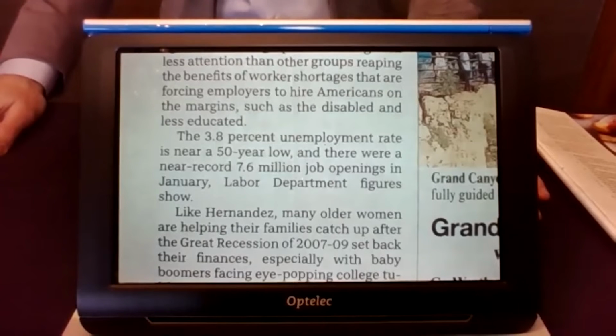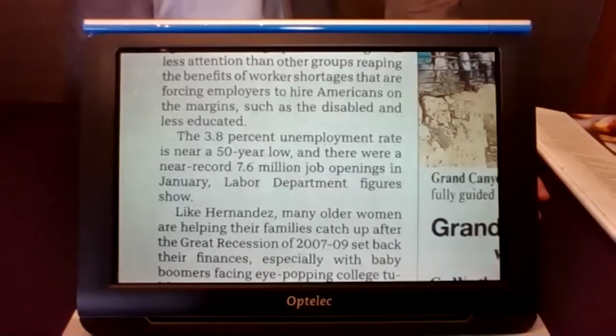So there's a good example there of the color accuracy, both for enjoyment of looking at photos, but there's a health risk there too, which is why it's important to make sure that we have that color contrast correct. I don't want to overpitch that, but it is an important aspect, of course. And by the way, I would like to show people the menu area here.